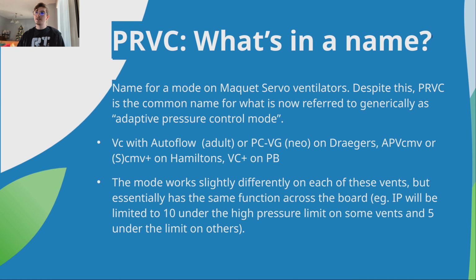So now we're on to the second part of the video. PRVC, what's in the name? PRVC is the name for a mode of ventilation on the servo ventilators, and I believe also some GE ventilators and the Avia as well. I don't actually know who owns the trademark or if anybody does. I think maybe the people in charge of servo do. I'm not 100% sure. But it's basically like a trade name for a certain mode.